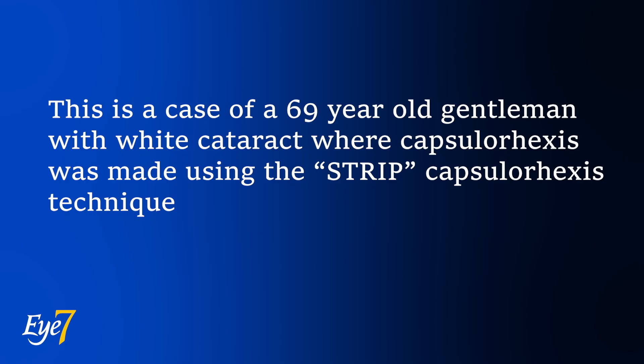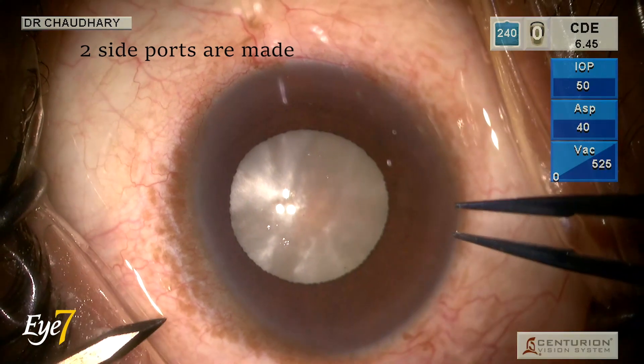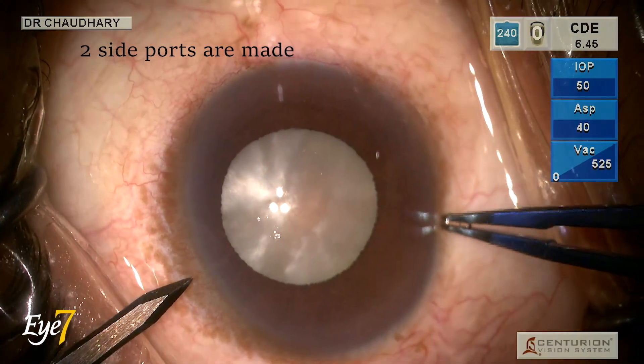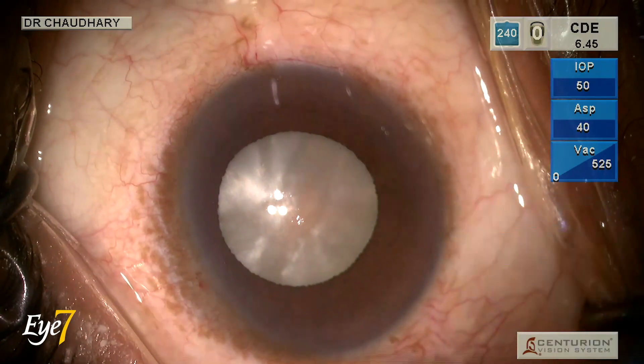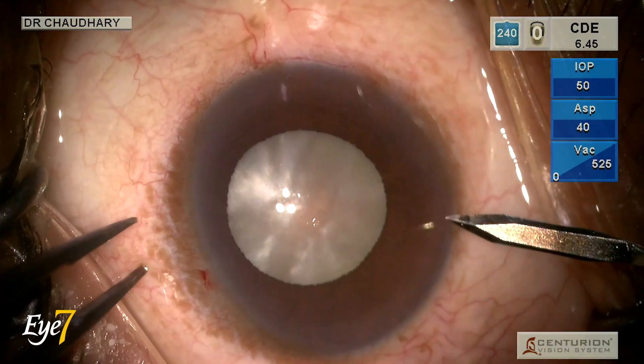Here we are demonstrating a case of a 69-year-old male patient with white cataract. Two side ports are made using a 1.2 mm blade, and these side ports are used to stain the anterior capsule using Trypan Blue dye under air.